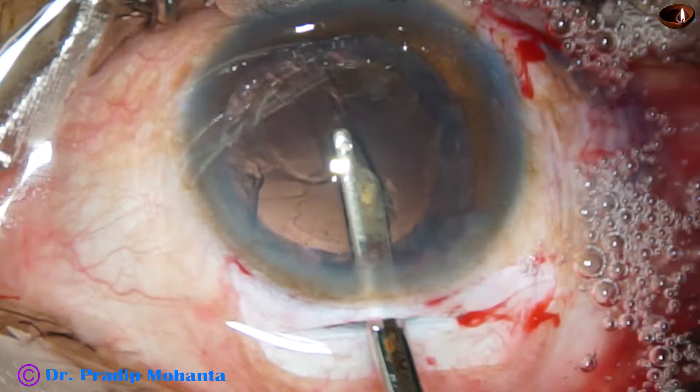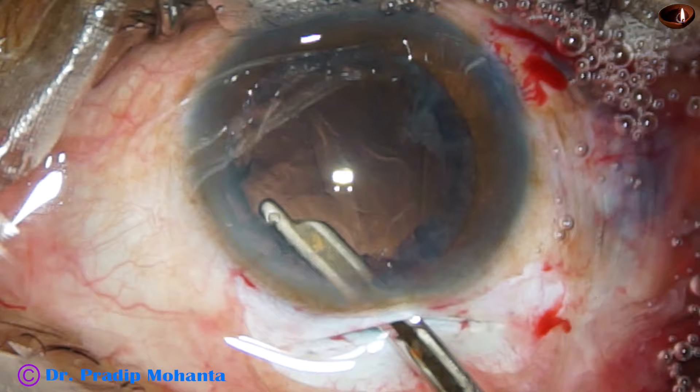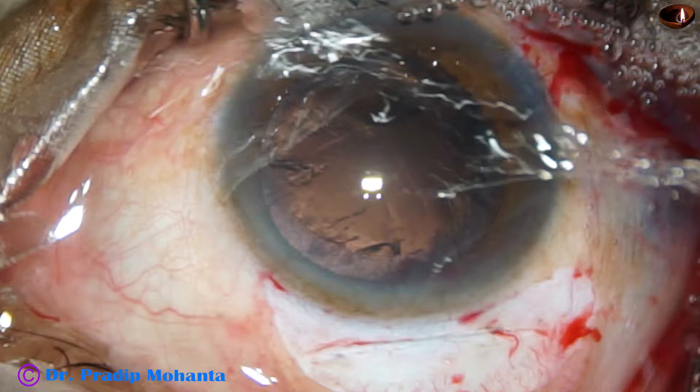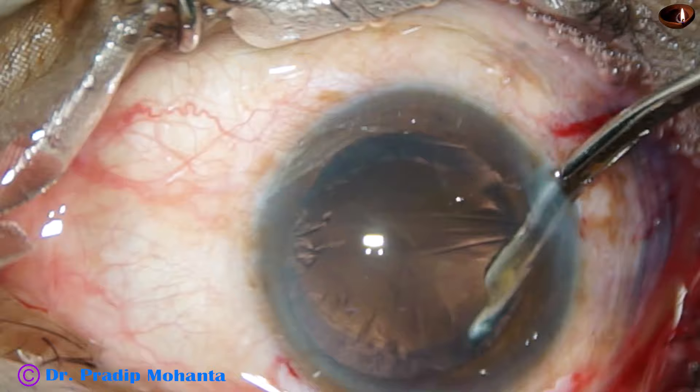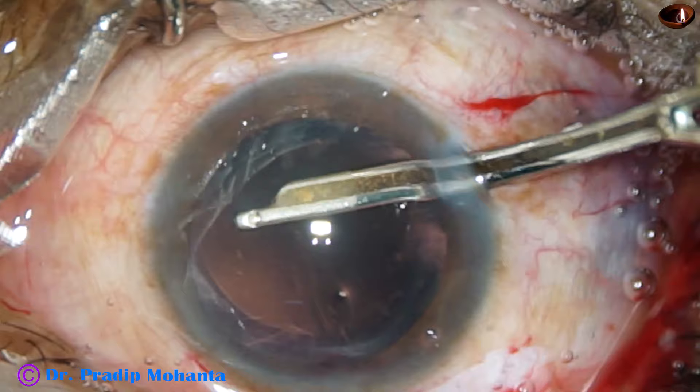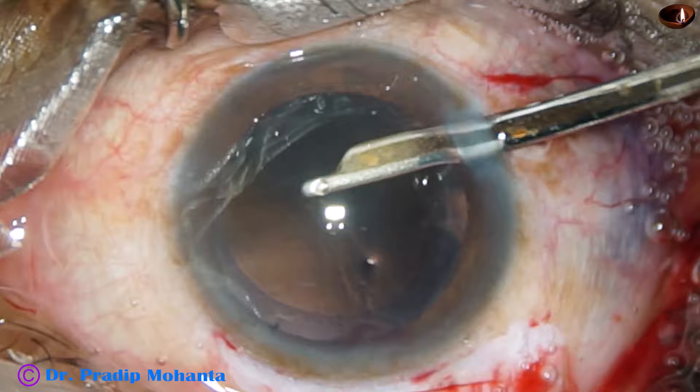Cortical cleanup is done with a 23-gauge Simcoe — this can also be a 22-gauge or 20-gauge Simcoe, but in that case we have to make the side port larger. First, we remove the soft side port cortex, and then we go through the side port and remove the cortex from all around — from 12 o'clock, 1 o'clock, then 4 o'clock, 3 o'clock, 5 o'clock, and 6 o'clock. The cortex is nicely cleaned.